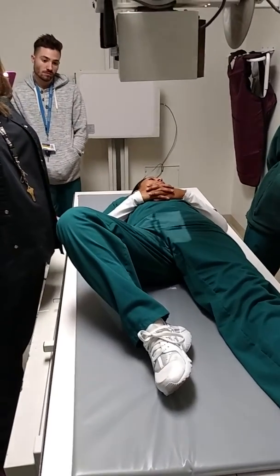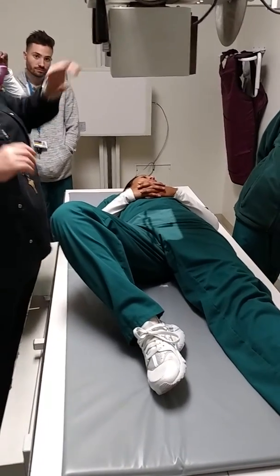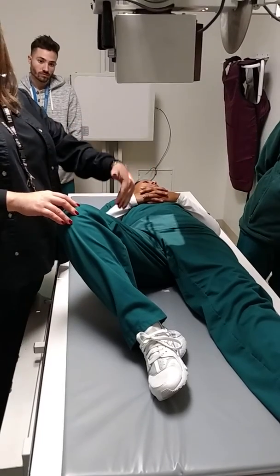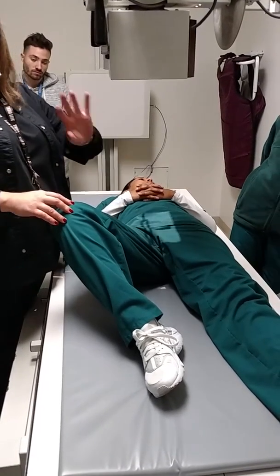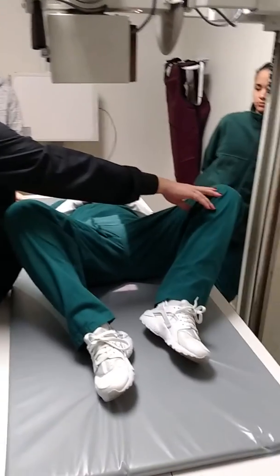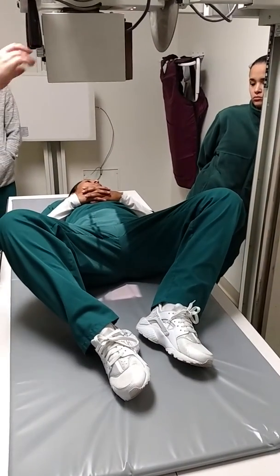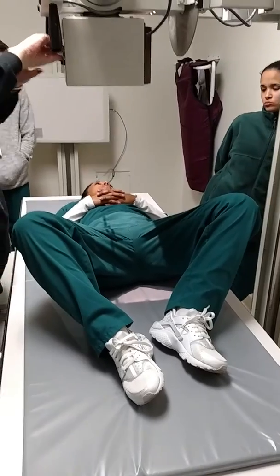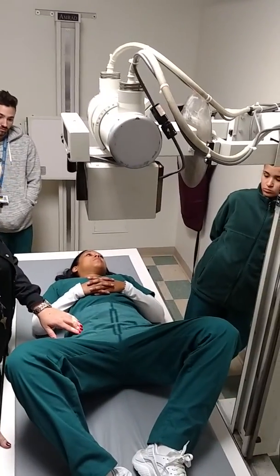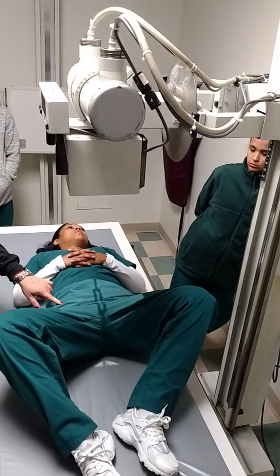Bilateral frog leg. If somebody orders a right and a left hip, you're not going to do the AP and the lateral, because that's 4 pictures. So you can get both laterals like this. I'm going to do a double frog, and it's a 14 by 17 landscape, and the central ray is 3 inches below ASIS. So here's ASIS. So 1, 2, 3.